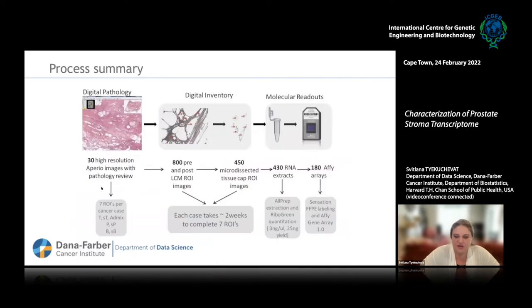The process of the laser capture microdissection was really labor intensive. It took a couple of years to perform this experiment. There were high resolution samples, high resolution Aperio scanned images that pathologists annotated. Then they were laser capture microdissected based on the pathologist's annotations. Multiple caps were captured, and then the molecular readouts were done using the Affymetrix array.